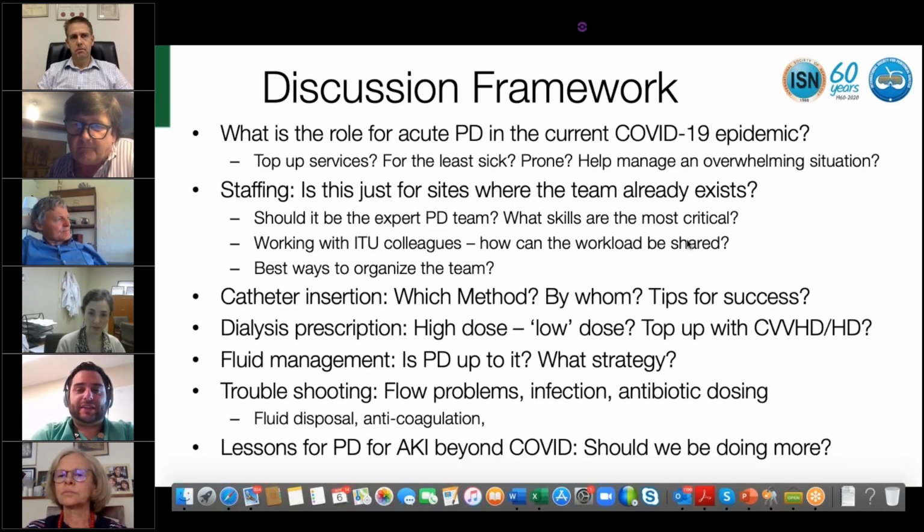Yes, I think we were very similar in that quickly we realized our services were inundated. We just did not have the capacity with the CRRT machines and the nursing ratios. Our acute hemo nurses were working 18 hours a day, and it was just impossible to keep up with the demand. And so out of necessity, we decided, why not try acute PD? We were already doing urgent start PD. We have a pretty robust home program at LSU. And so it just seemed like a natural trial for us to do this using the ISPD guideline.